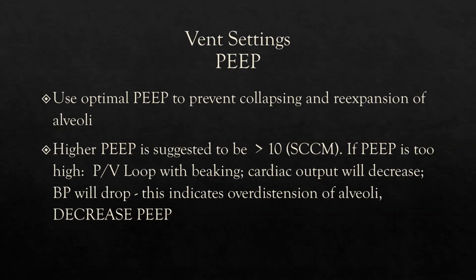So you ask everybody and then you see. But even different textbooks will have different values, like Oakes always seems to have different numbers than I have, so it's kind of hard to say. So when the venous oxygen saturation is dropping, that tells you that you've got too much PEEP and you're actually preventing the flow through the pulmonary capillaries, and your gas exchange is compromised. So it's when the venous saturation drops.